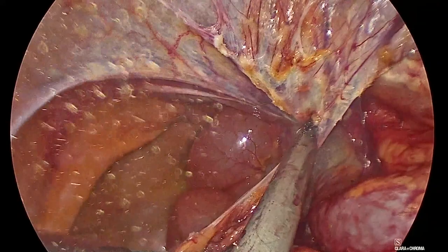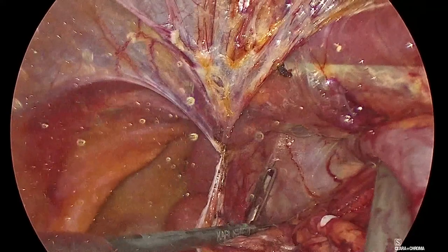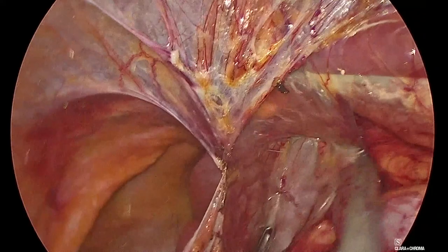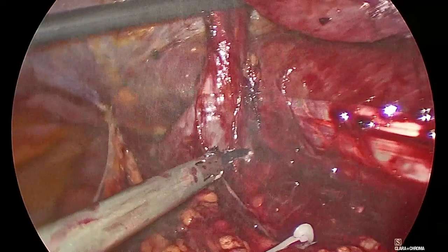The patient had already an incision for an appendectomy. And so I think that here is bowel there. We go down there, we take care of the ureter, and we will use the camera maybe to show you the inside part of the surgery if you still want to see something.